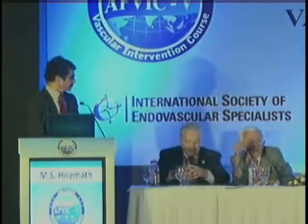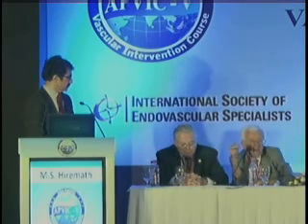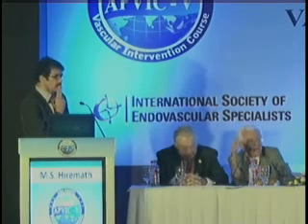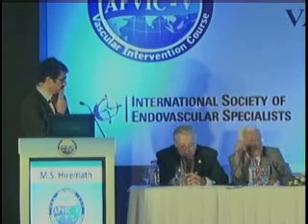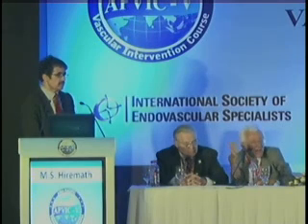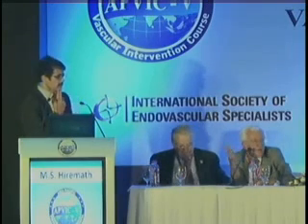And for carotid, I don't recommend covered stent for carotid because there is a study also, a small study, I don't remember the exact number, but less than 20 patients treated with covered stent, and the complication rate was very high and a lot of thrombosis, maybe 20% of thrombosis in carotid. So I think except aneurysm, I don't recommend to place covered stent in carotid. Do you agree with that?